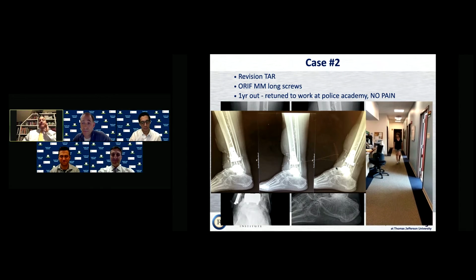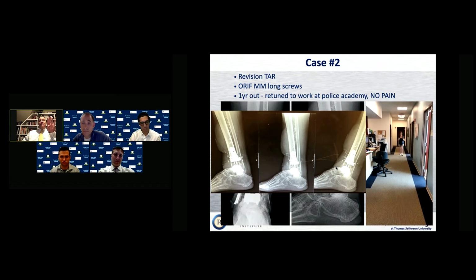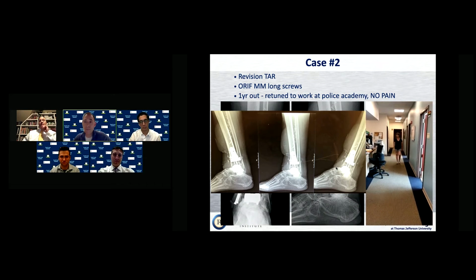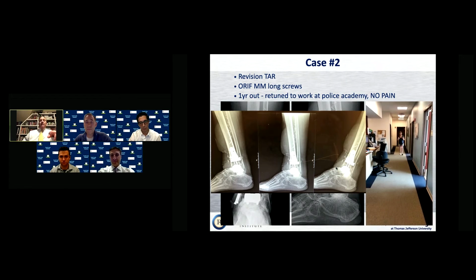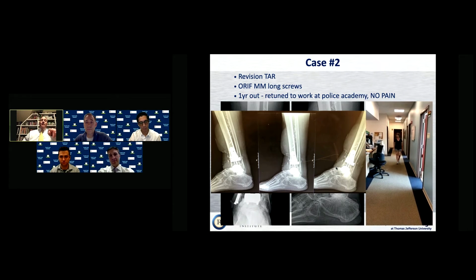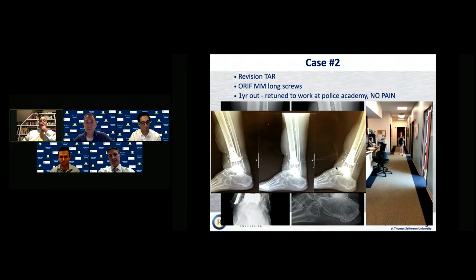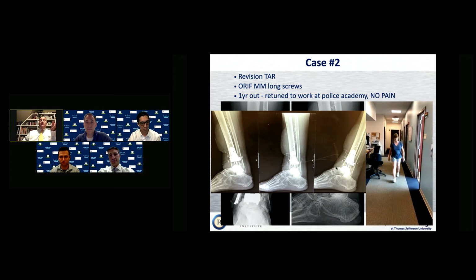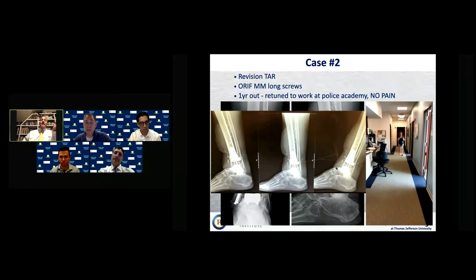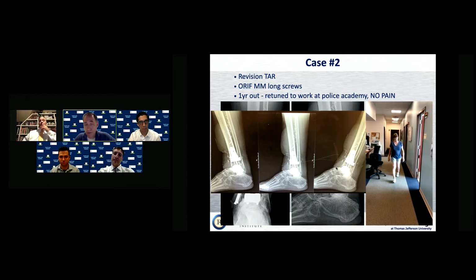This person had, prior to that revision total ankle, 4 operations on this ankle. Is that right? Right. So my take personally would be to go to the nail with a cage, autograft, and say your prayers that it didn't get infected. But your next move after this would likely need to be a transtibial amputation because you're running out of soft tissue. If it didn't work, we could still use the cage here.